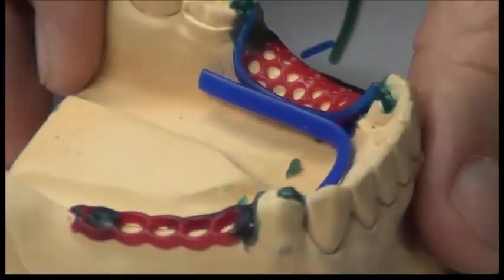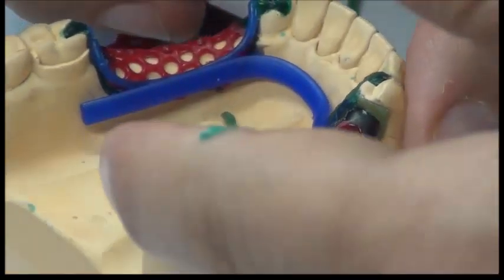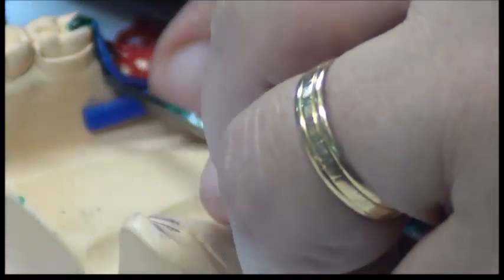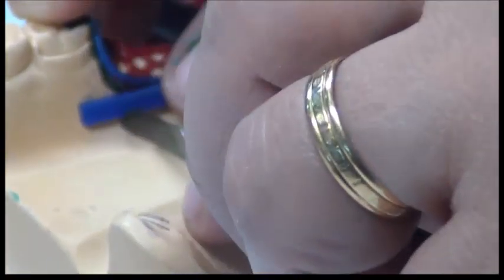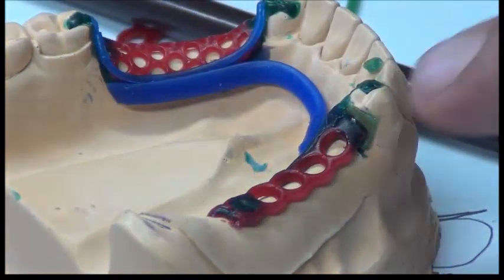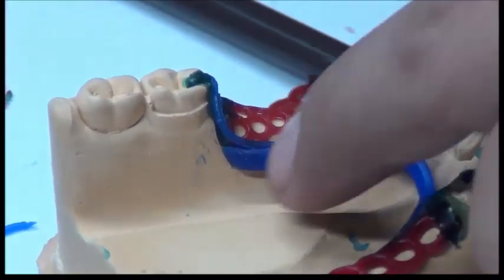So this is the morphology of it. Once more, it extends from the bounded saddle area. I'm going to cut also the excess. It runs along the external finish line of the bounded saddle area, up to the last part of the bounded saddle area.